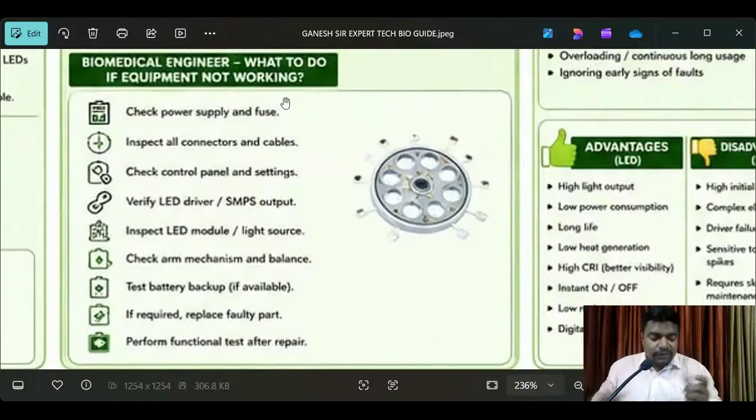So first of all, whenever you get a complaint that the light is not turning on, you have to check the AC power supply, raw power or UPS power connections, and where the main power supply is. Then you have to check both terminals using the multimeter. It's very, very important. Before checking, you have to wear sandals, because sometimes earthing can also give a reflected shock, and sometimes earthing phase can carry high voltage. You should be very careful and protect yourself with insulated footwear also.